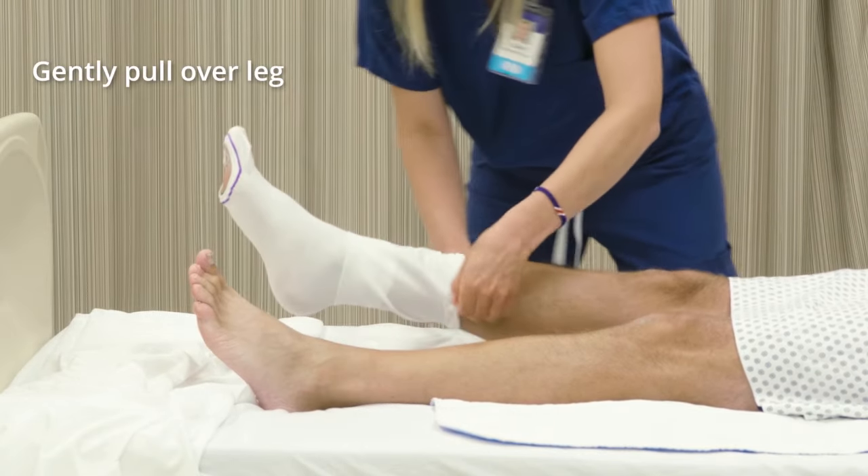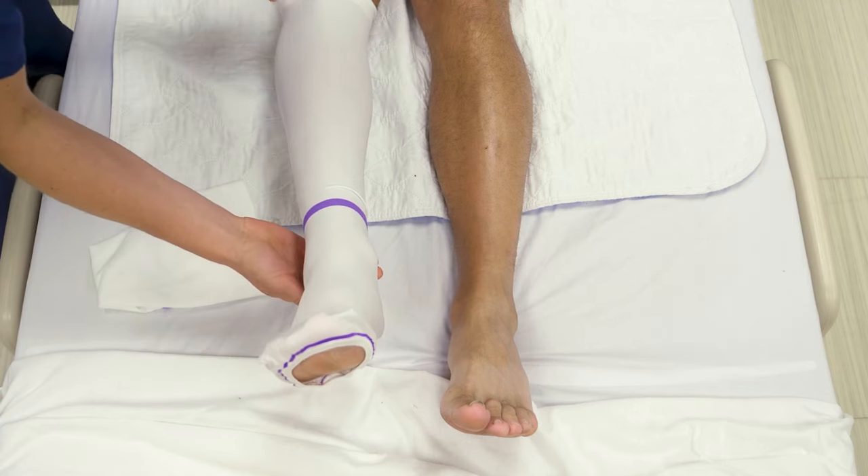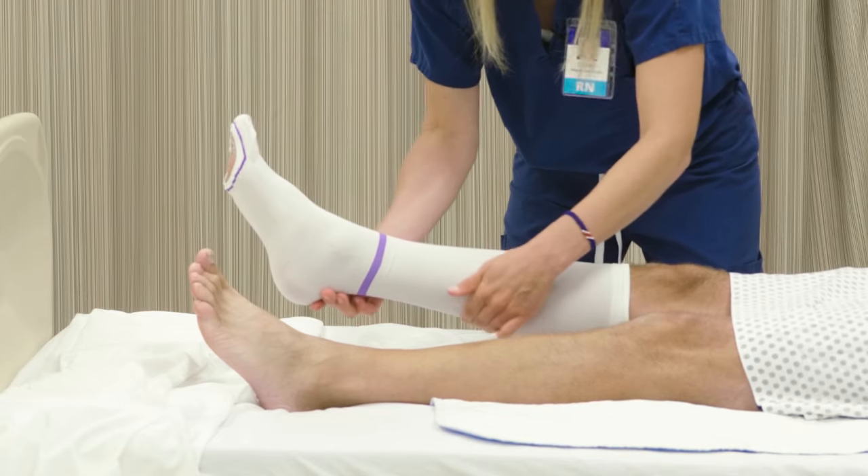Pull the top of the stocking over the foot, heel, and leg. Move the foot and leg gently and naturally, avoiding excess force and overextension.